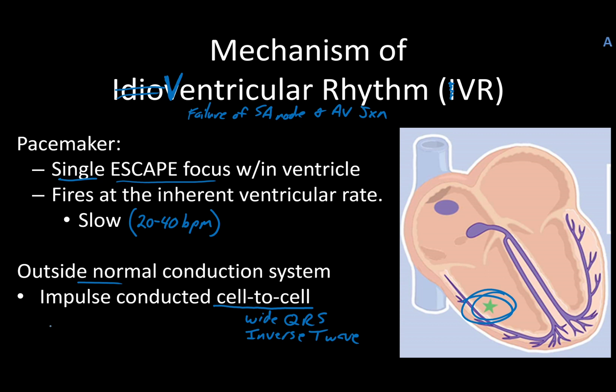The best way I can phrase it is to call it a PVC rhythm. That's regular. When we take a look at these, you'll totally understand what I'm saying. But again, this is an escape mechanism. It's that last-ditch effort to try and keep the organism alive.